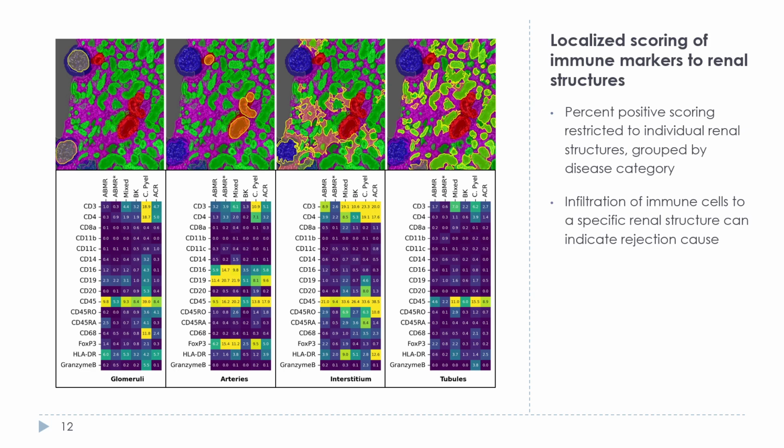The main strength of this approach is that it guides cell type discrimination through the eyes of an expert observer, but we'd also like to investigate heterogeneity through an unsupervised clustering approach. So, to get the best of both worlds, we can leverage the cell classifications to annotate cluster names rather than doing this blindly in conventional workflows.